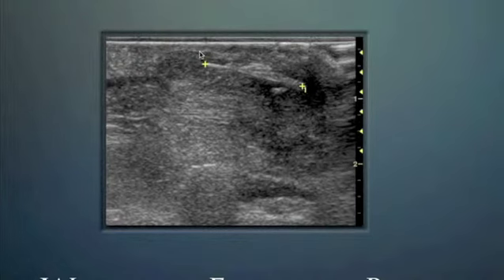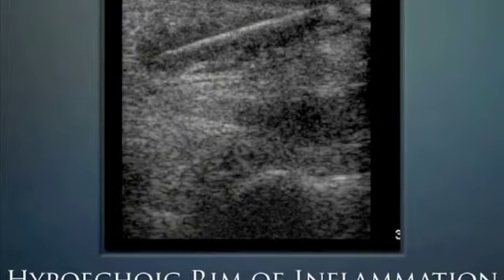And when a foreign body's been there for a while, there starts to be a buildup of inflammation. 3 to 5 days out, you can see this inflammation, or this hypoechoic rim here around this particular woody foreign body. And this hypoechoic area also helps to visualize it.